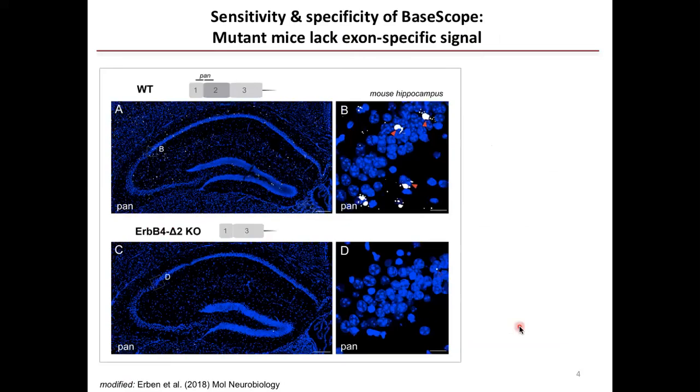As you heard from Mohammed's presentation, the sensitivity of BaseScope allows for the detection of short RNA sequences. In addition, the chromogenic detection dye used in BaseScope, called FastRed, can also be detected fluorescently in the red channel. In the study I will discuss, we mostly use fluorescence detection. For the ease of presentation, I have pseudo-colored the red signal to white.